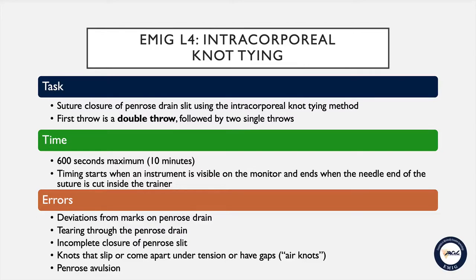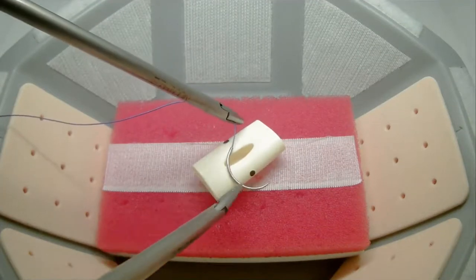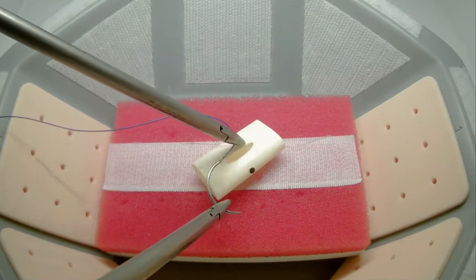Additional errors include knots that either slip or come apart under tension, or have gaps in them — also known as air knots — and penrose avulsion. Timing begins when an instrument is visible on the monitor.